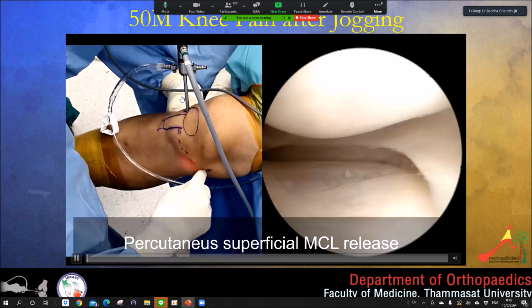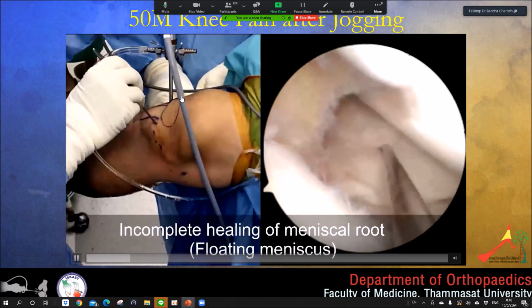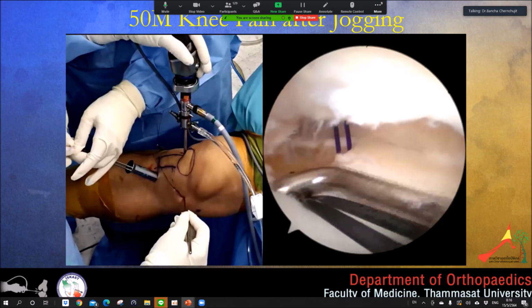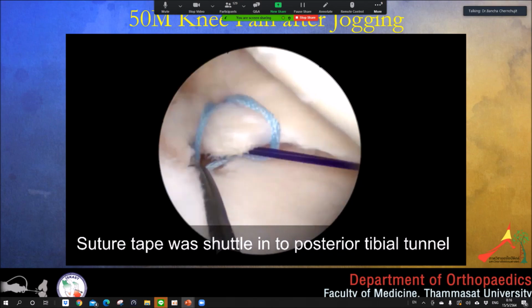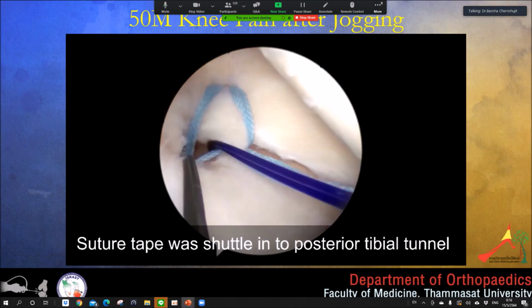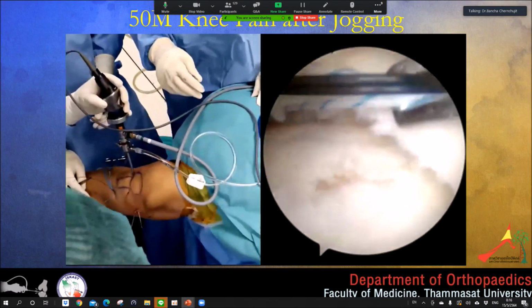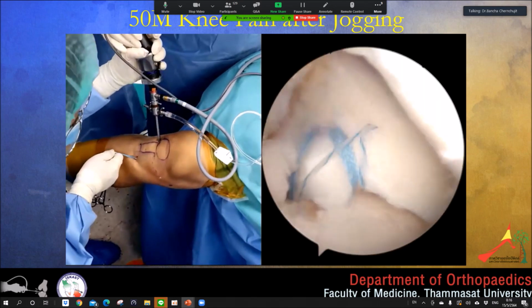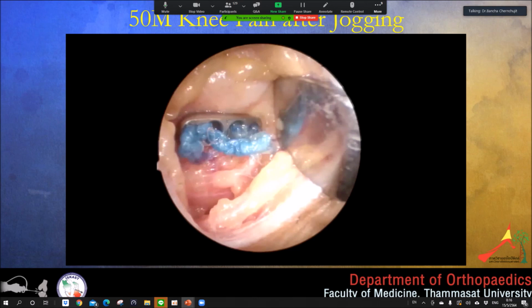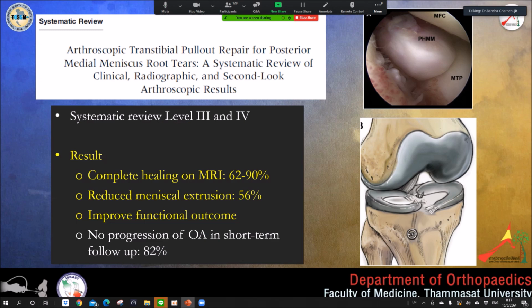So the trick is that, yeah, this is one patient, 50 years old. He had the meniscus root tear. Okay, so the double tunnel technique, you may have better contact surface, like you do a double row of a rotator cuff repair, right? And you have only 2 holes, okay, suture fixation to the button. So this technique, you have better contact area. Instead of point contact, you have the area contact using the double tunnel technique, okay?